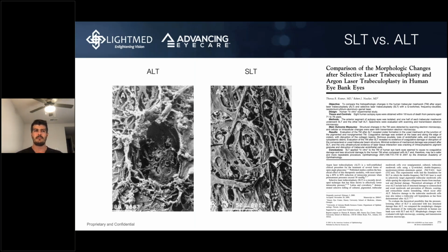Do you routinely have patients wash out topical meds prior to SLT? Depends on how bothered I am by them being on the eye drop. If it's a patient that's on latanoprost, let's say, and I know the latanoprost has brought the pressure down, and I know that the patient does not have a lot of side effects of latanoprost, they're overall doing okay in terms of compliance and side effect profile with latanoprost, and I realize, well, I need my pressure to be lower, I'm going to keep the latanoprost. There's no reason why to wash it out. I'm just going to go for the SLT.